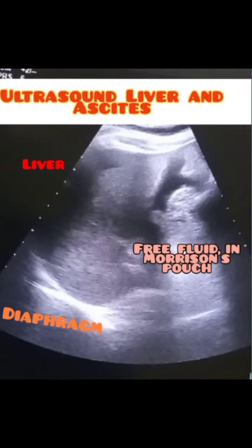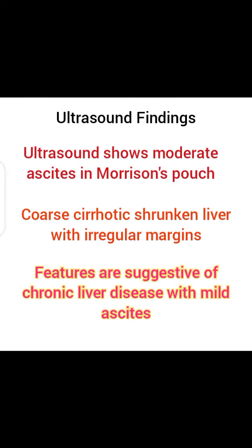This is a picture of ultrasound liver and ascites. You can see the liver, diaphragm, and free fluid in the Morrison's pouch. The ultrasound findings show moderate ascites, coarse cirrhotic shrunken liver with irregular margins — features suggesting chronic liver disease with mild ascites.